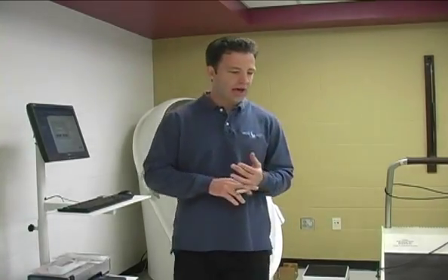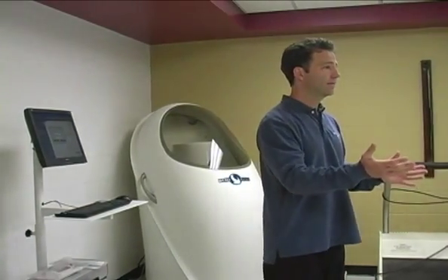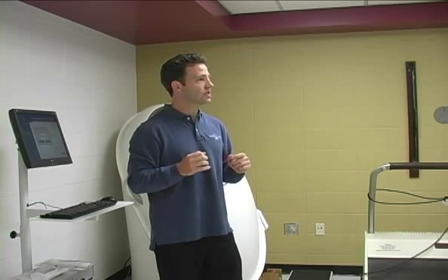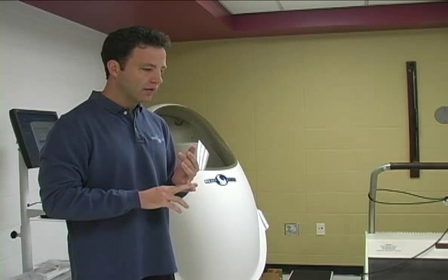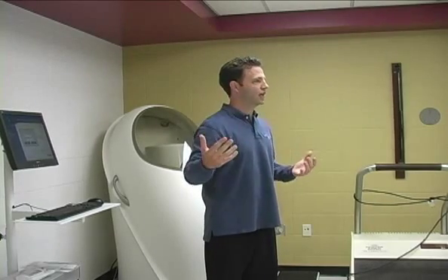There was a researcher at UC Davis, her name's Susan Akins, in the early 90s, and she was doing, are you familiar with underwater weighing? We've got a team. Okay, so you're familiar with Archimedes' principle and underwater weighing. She was doing her master's thesis at UC Davis, with a research protocol with elderly and obese. And as you can imagine, it was very difficult to administer the underwater weighing or hydrostatic weighing test to those individuals because of the limitations.